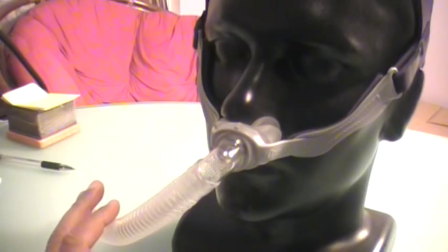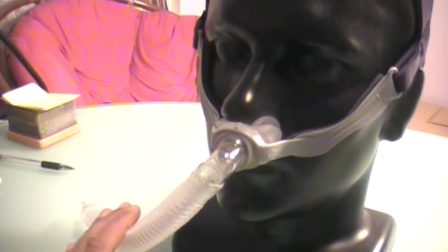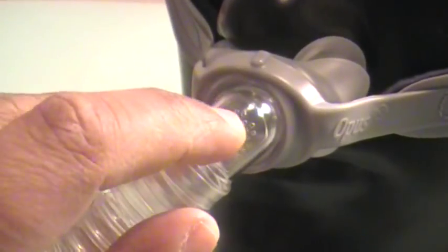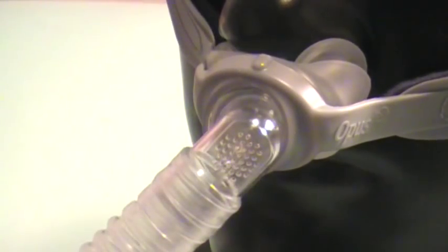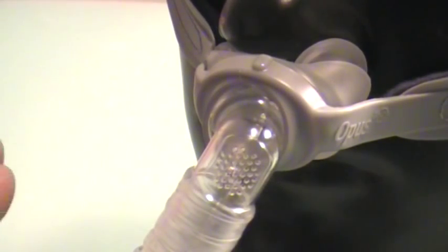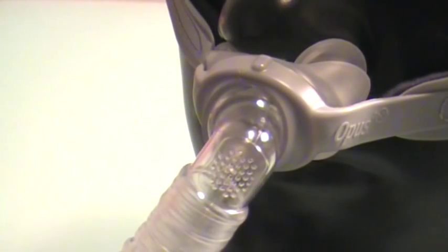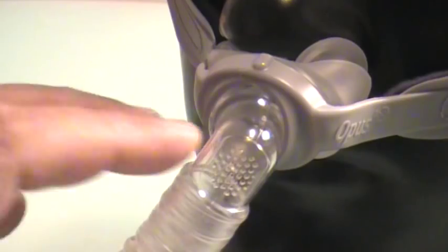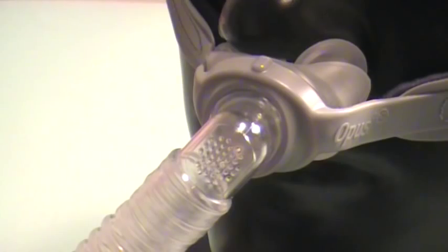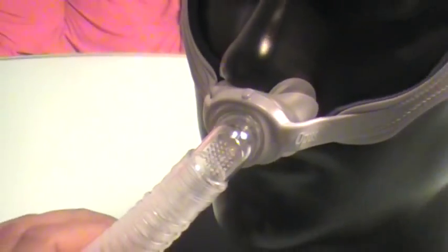Now let's talk about the exhalation port. When you exhale — let me zoom in — you see these little dots? That's your exhalation port. It's very quiet and does a very good job not blowing air into your bed partner. You will always find exceptions, and someone may complain their partner is getting hit by the air, but generally I have not had any complaints from this particular nasal pillow, the Opus 360.